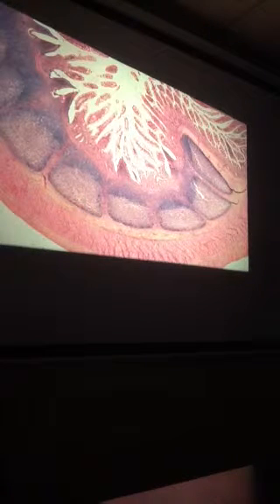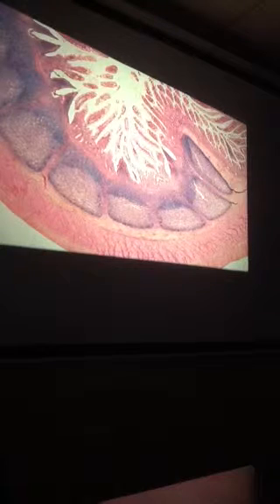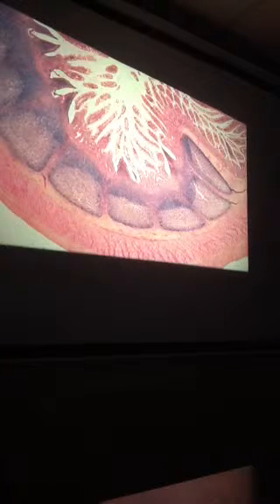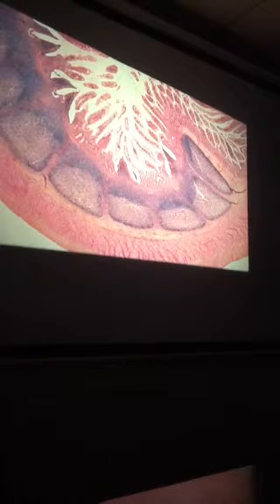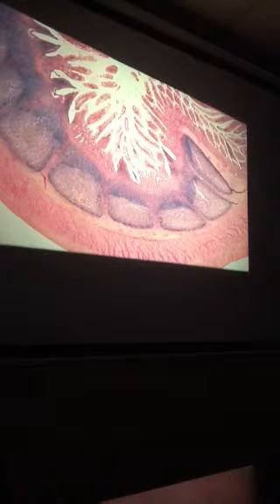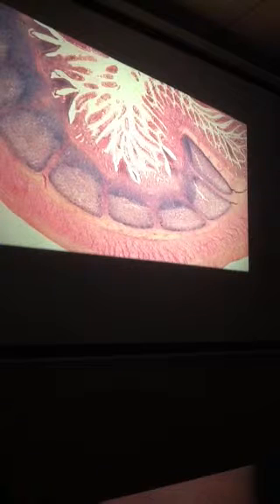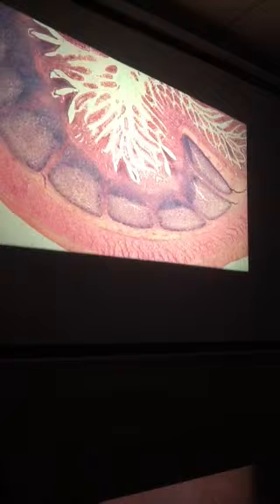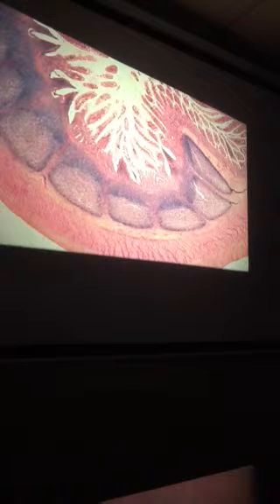This, and this. What are these 3? Villi. Fingers, right? What are these? Crypts. At the base of the fingers. Now, true, there are a lot of goblet cells, but I would have them much more magnified if I would ever have to identify those. They're too small for any good identification. But it's just seeing the fingers, the villi.